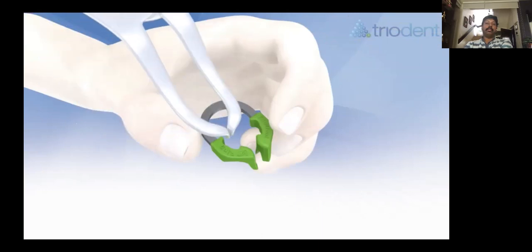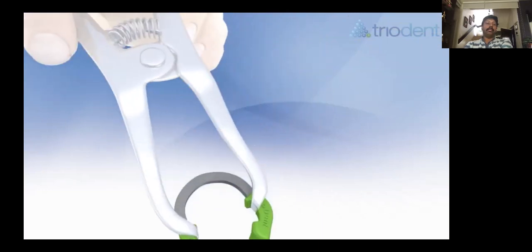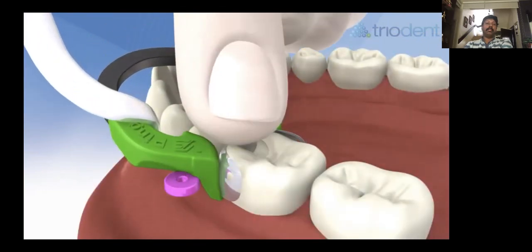The assistant passes the forceps with the V3 ring safely locked in. Do not overexpand the V3 spring. Carefully and without rushing, place the V3 ring. Press down with a finger on the matrix tab while removing the forceps. This prevents movement and keeps the ring down.